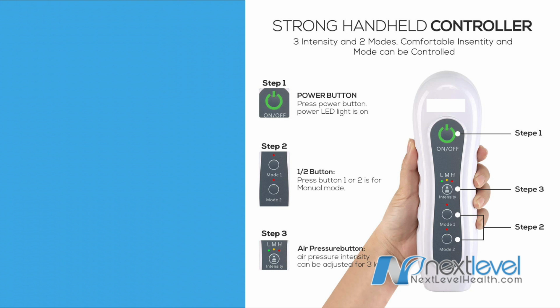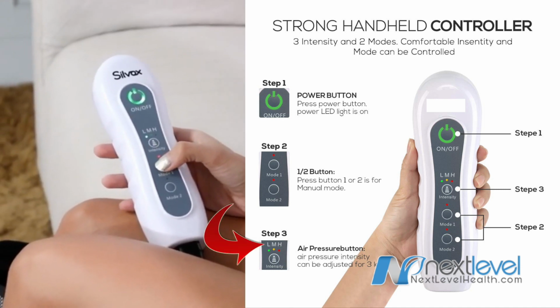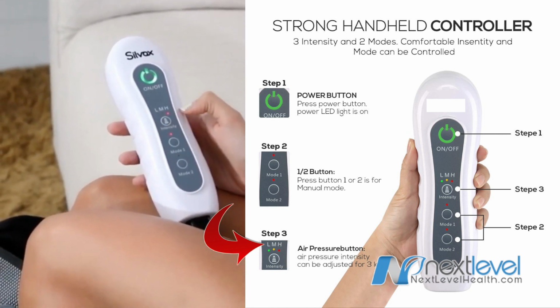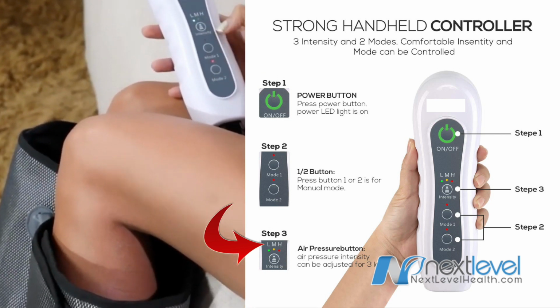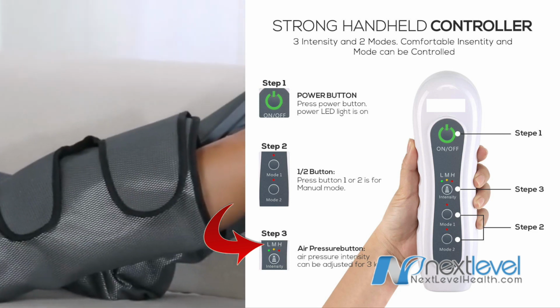And finally, depending upon the version you have, press and hold the power button down and start at low intensity and work your way up to tolerable tension, but start at that low intensity. It typically will have a low, moderate, and high intensity. Start low, and it should be tolerable tension and not painful.